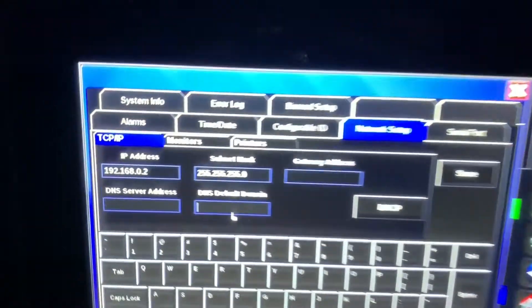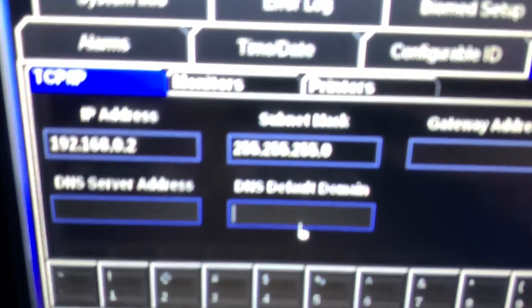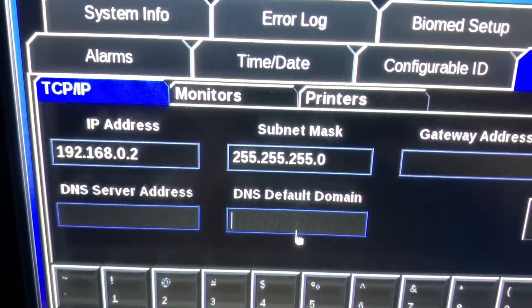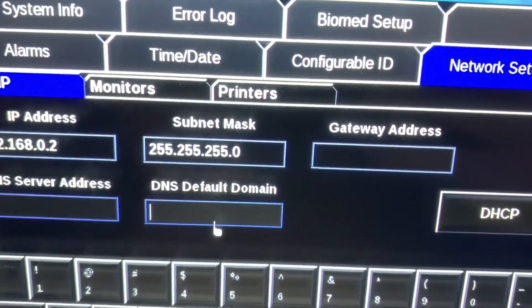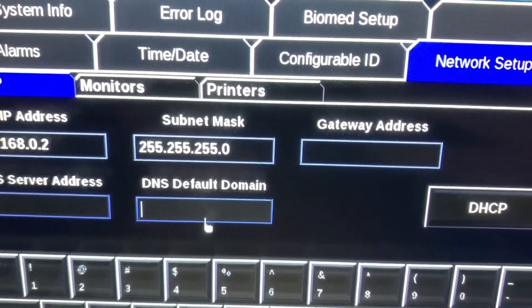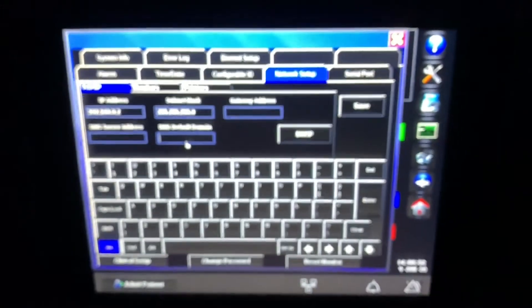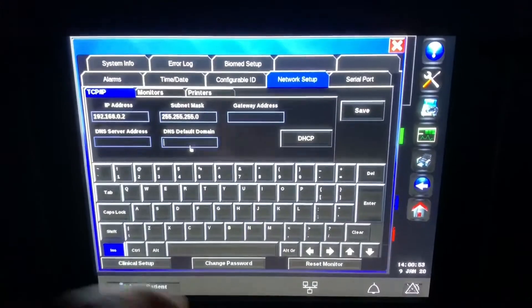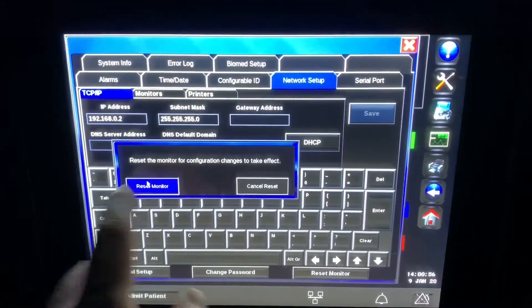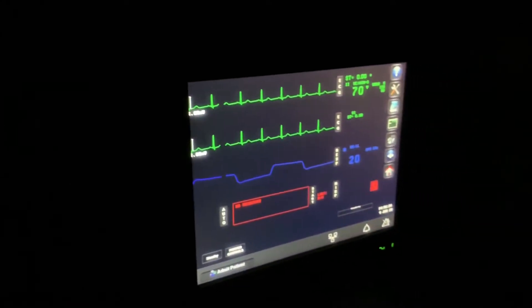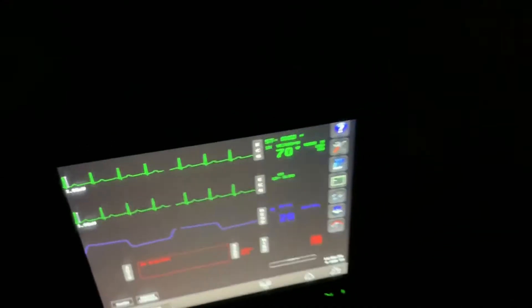Just like that one over there, I set this one to its corresponding IP address 192.168.0.2 with the same subnet mask as before. Now I hit save and reset monitor, and this will reset. I'll turn the lights back on and show you the rest of this.